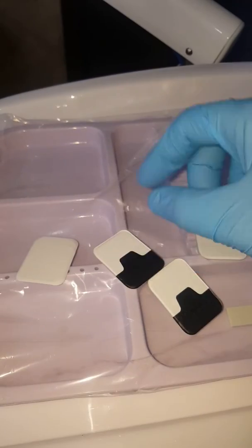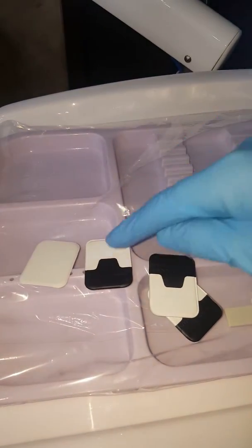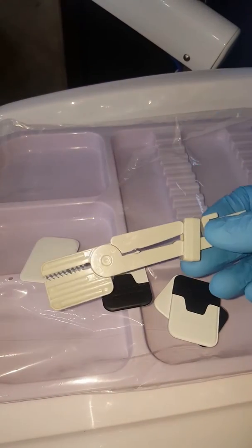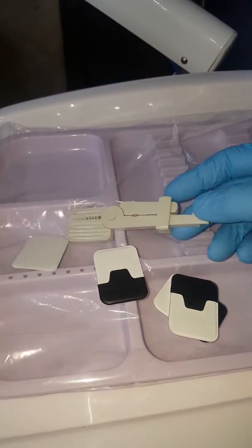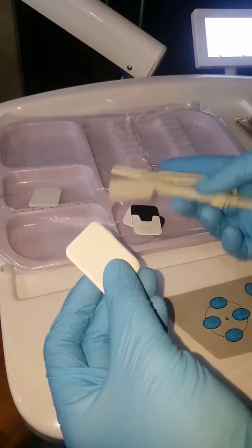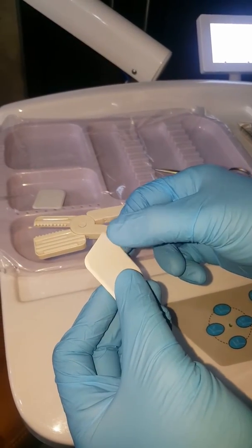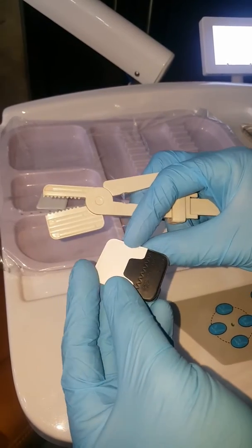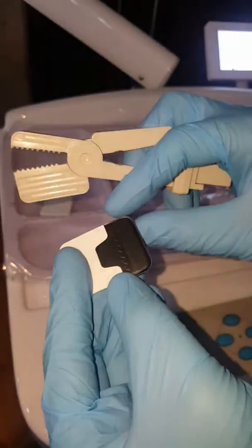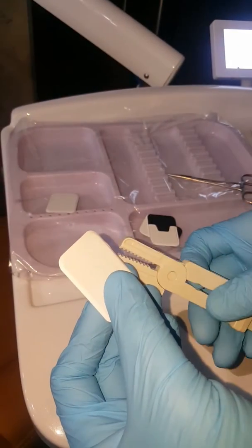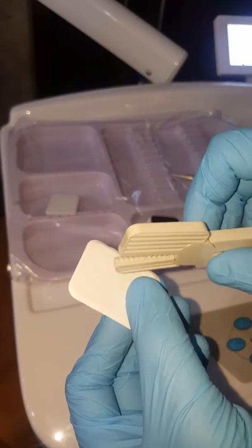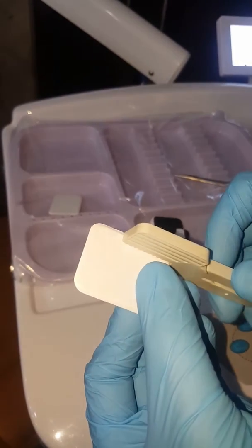One by one we can go through all the films, and even if the films are jumbled together, you know exactly which one is exposed and which one is not. We use a film holder to hold the film properly, or you can also use a hemostat. You'll notice a little pimple on the film, also drawn as a little circle in the back. The circle needs to go towards the occlusion so it does not give you a wrong view of the apex. If this pimple shows up at the apex, you might think of it as a periapical radiolucency.